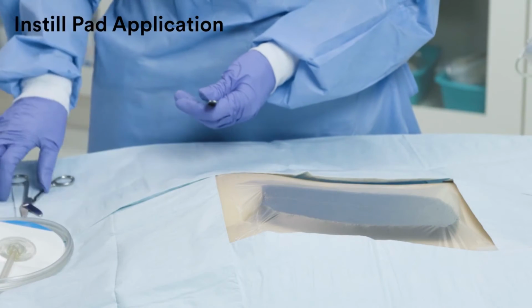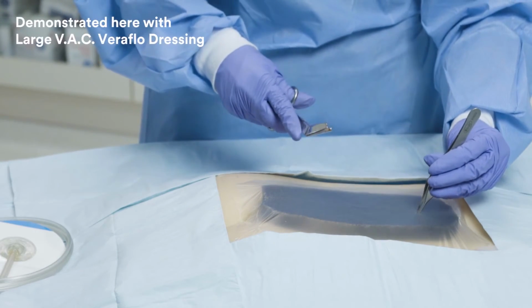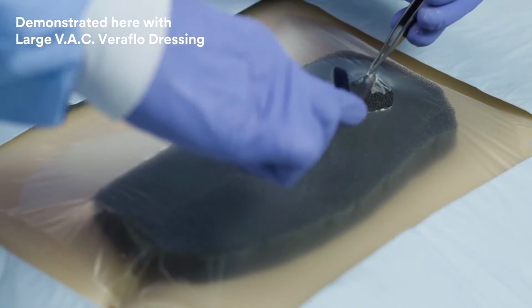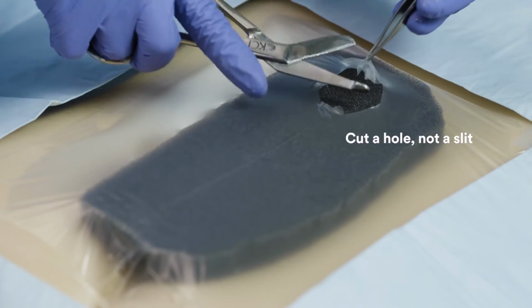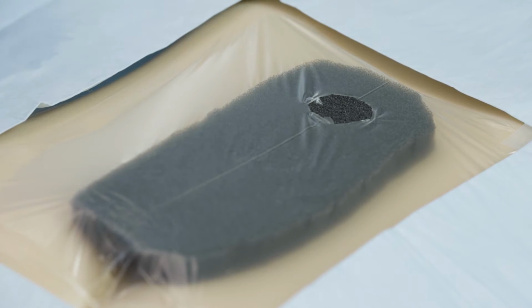To apply the V.A.C VeraT.R.A.C Duo Tube Set, choose the Instill Pad application site. Pinch the V.A.C Advanced Drape and carefully cut a 2.5 cm hole, not a slit, through it. The hole should be large enough to allow for removal of fluid and exudate. You do not need to cut into the foam.